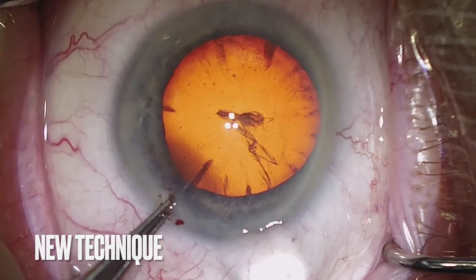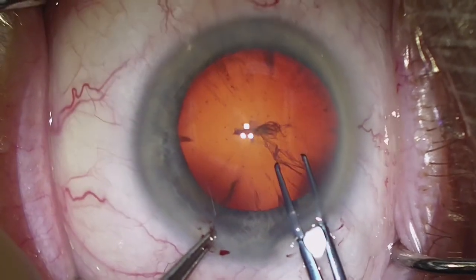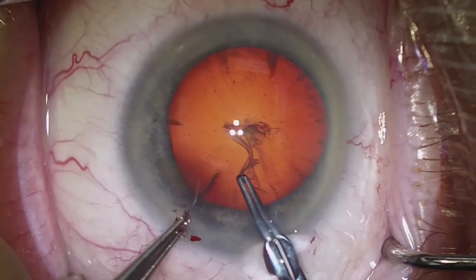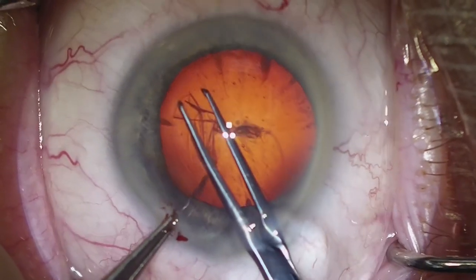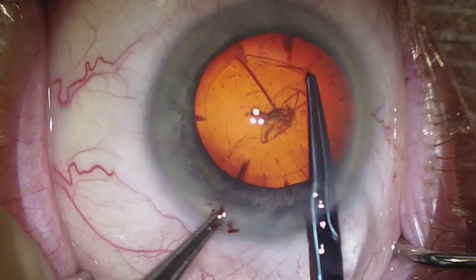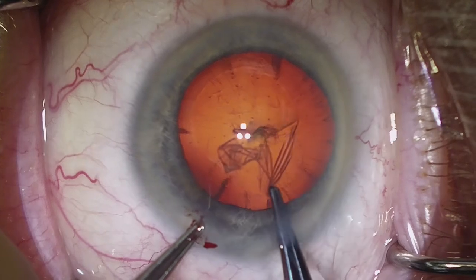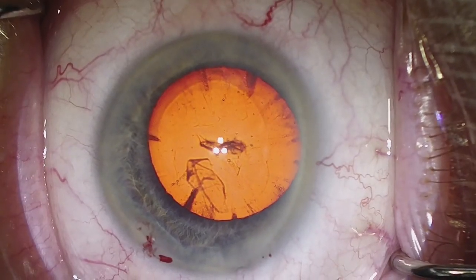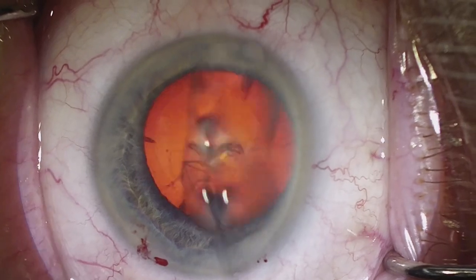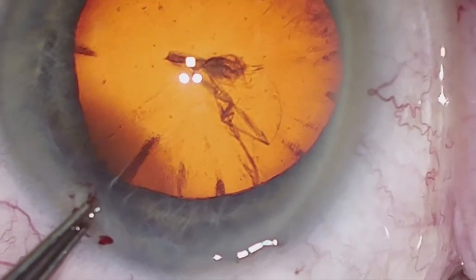We make just one continuous motion to start the capsulorexis, and then we can easily grab the leaflet with the Utrata forceps and smoothly and efficiently complete a continuous curvilinear capsulorexis. I'm going to show several examples of that with high magnification so we can better appreciate this one continuous movement, this one continuous motion.